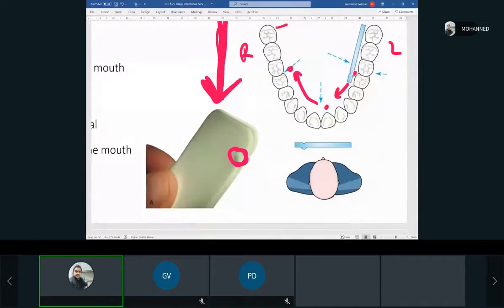So when I am mounting, for example, I have an X-ray from here, an X-ray from the right, and an X-ray from the left, and they're just mixed up. And I want to know which one is the right and which one is the left. Okay? So I say, okay, I place the dot always in the bottom. So let me place the dot in the bottom.